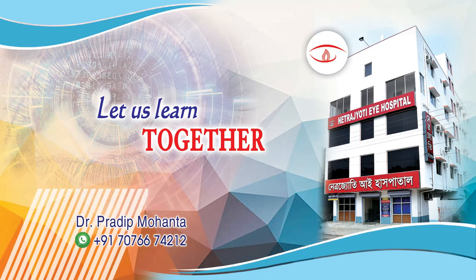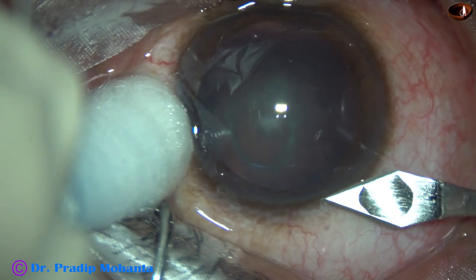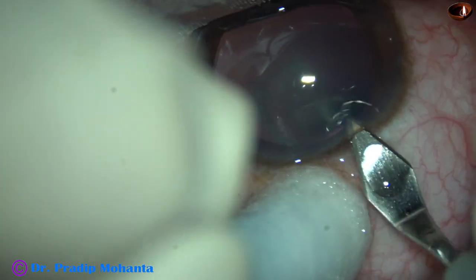Friends, welcome to my workplace at Ranakh Heart, West Bengal, India. This is a posterior subcapsular cataract with very soft nucleus. Let us observe this surgery.